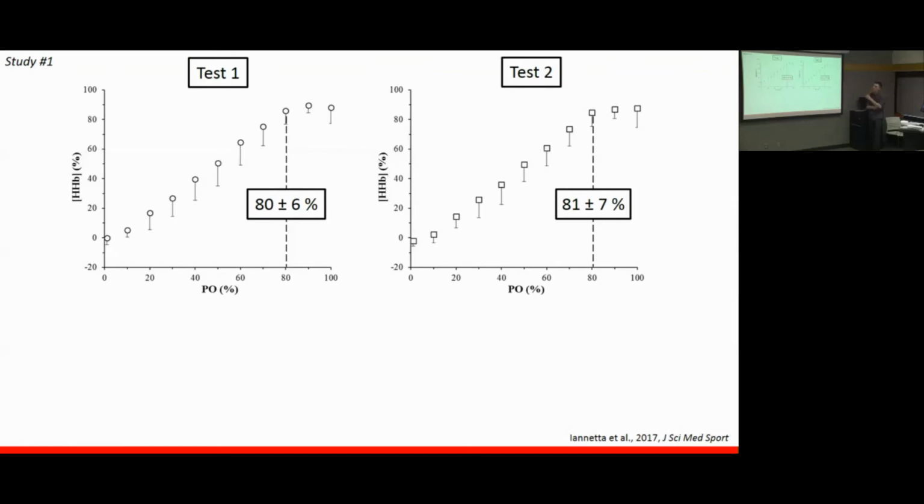Well, the resolution is, as I said, it goes as deep as 3 centimeters, and the area of investigation is a couple of centimeters square, so it's very small. This is again a little picture of the whole thing. So we are assuming that even in the vastus lateralis, everything is as I'm showing, but there might be differences between the distal portion and the proximal portion.